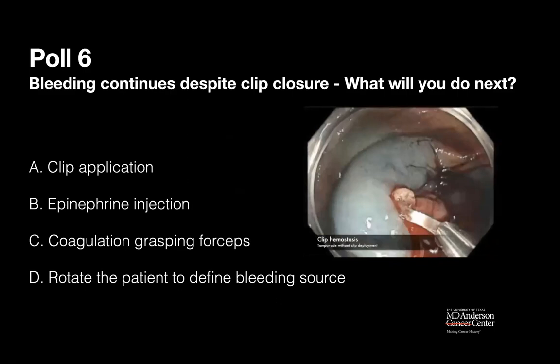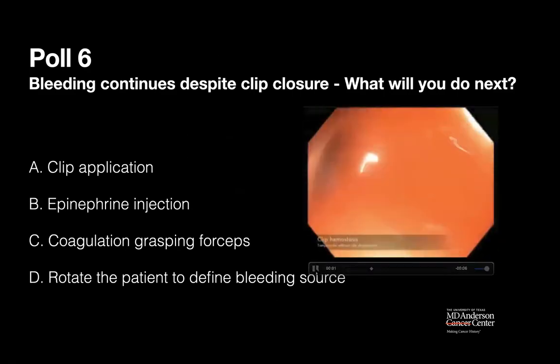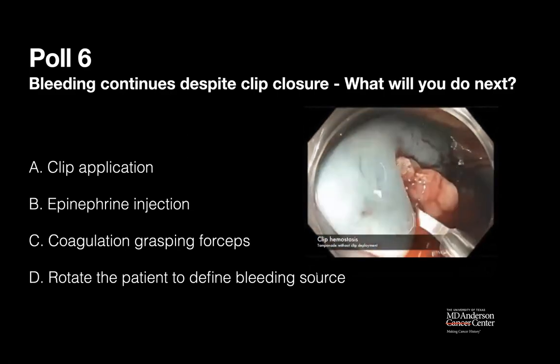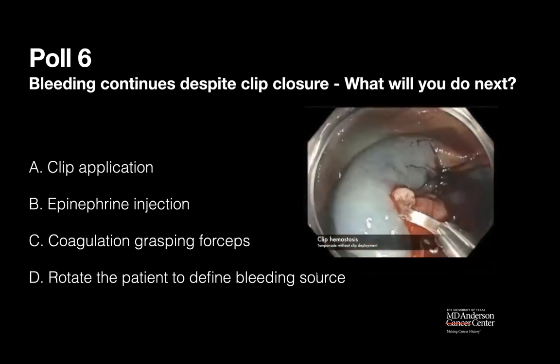In the old days, when we did a lot more moderate sedation, problems like that didn't seem to happen as much. So you need to say, please don't sedate so much. Just sedate more lightly. Then you can do this type of procedure much more precisely.